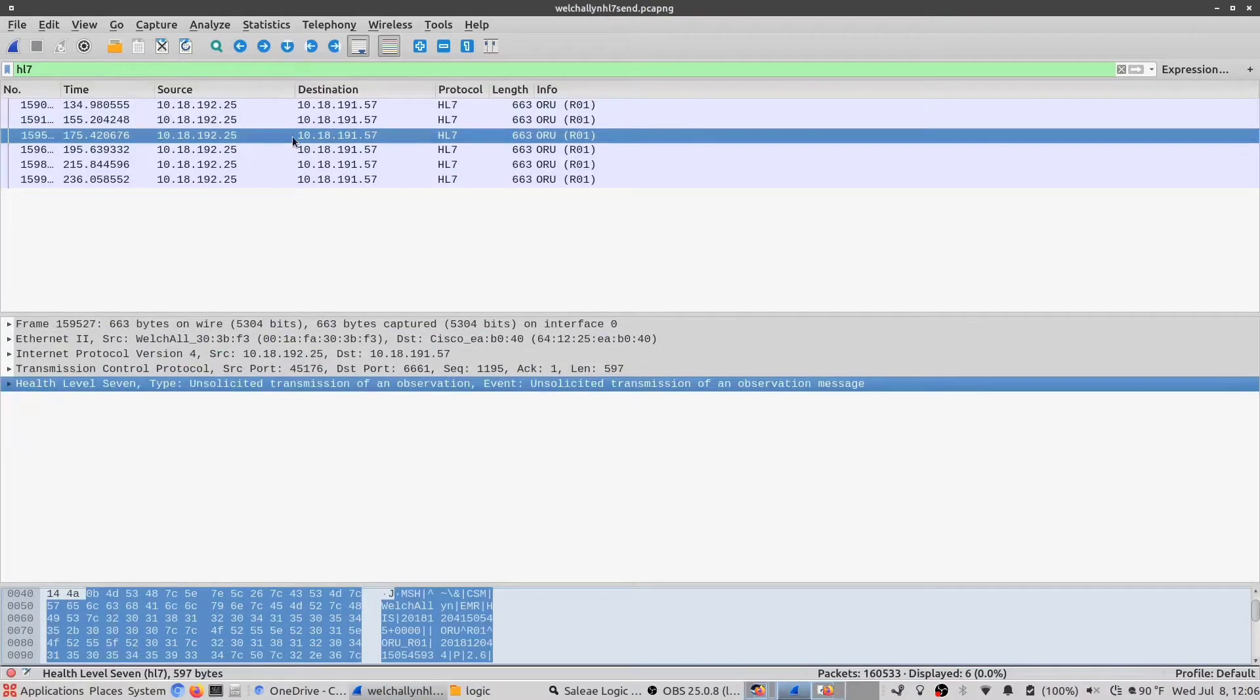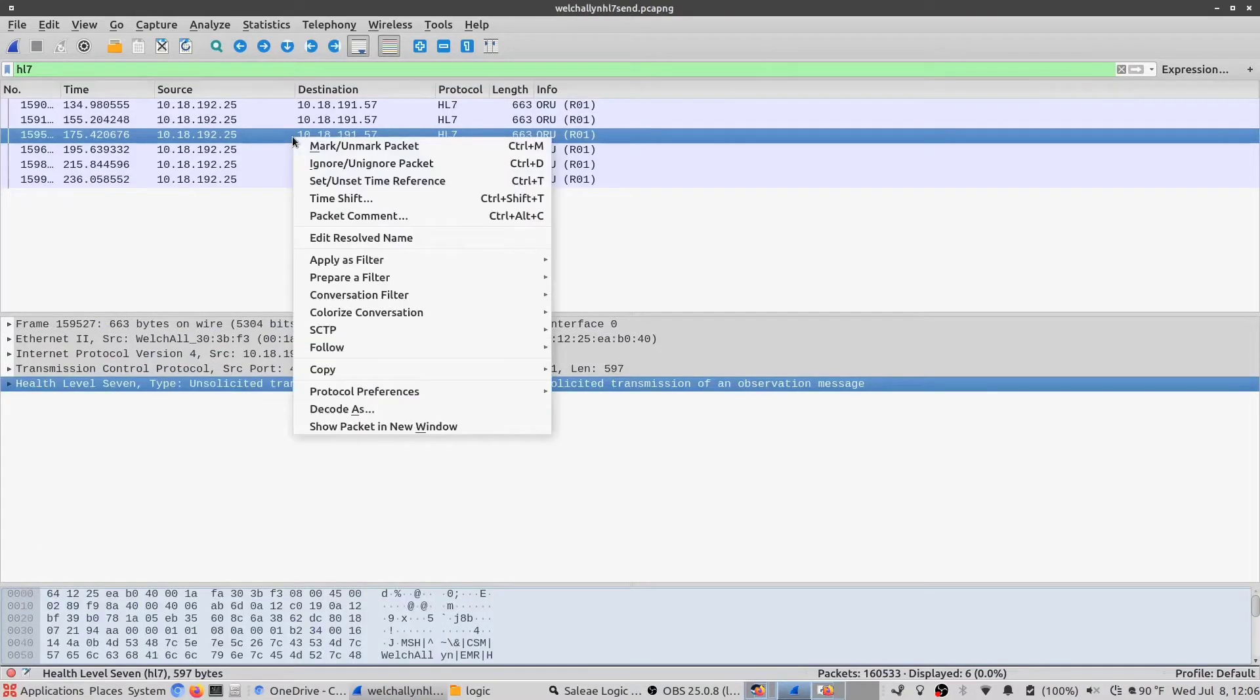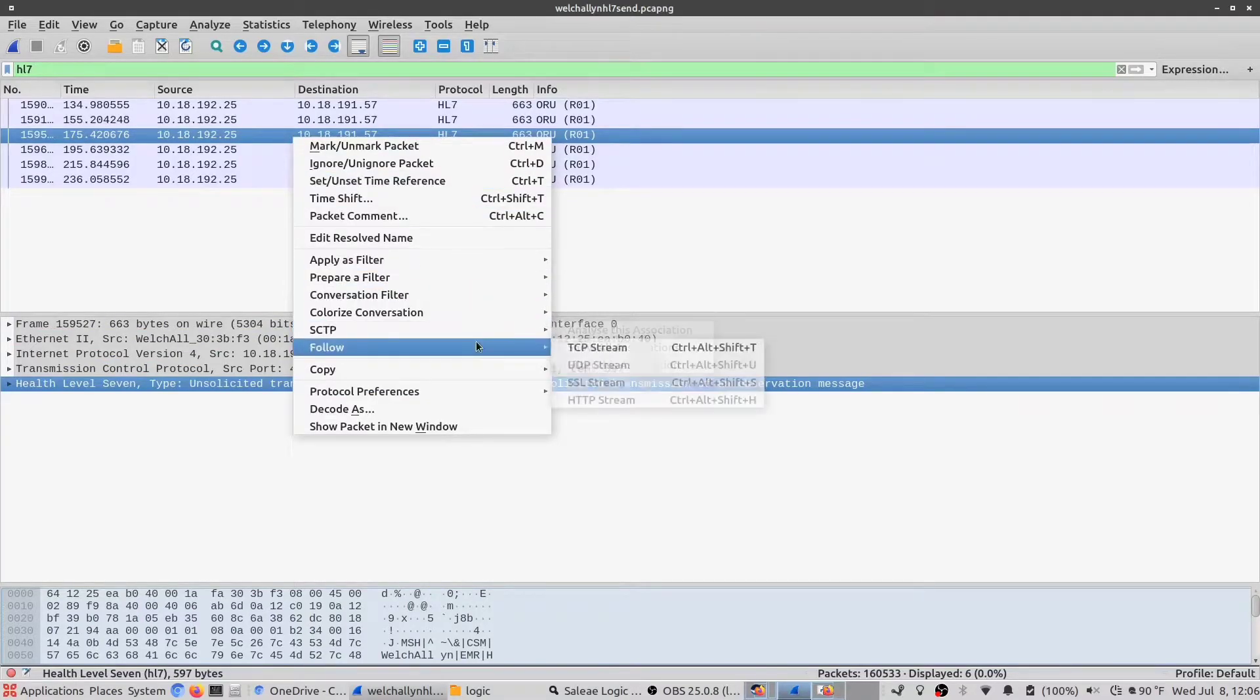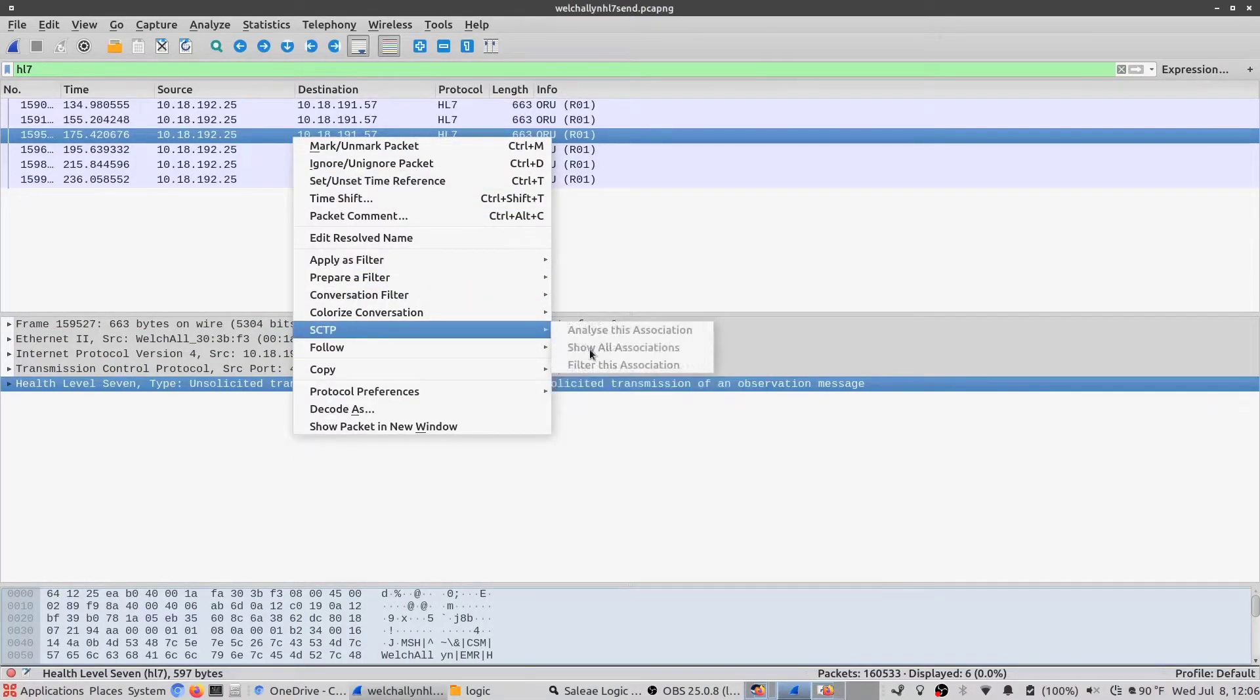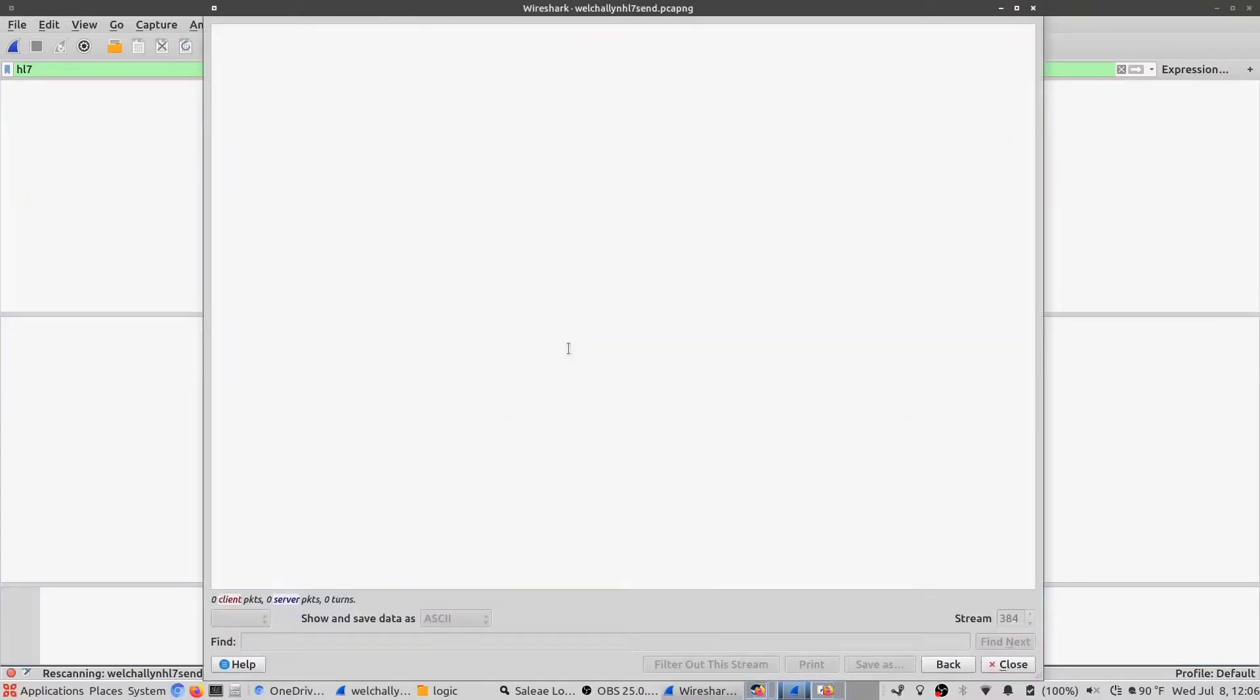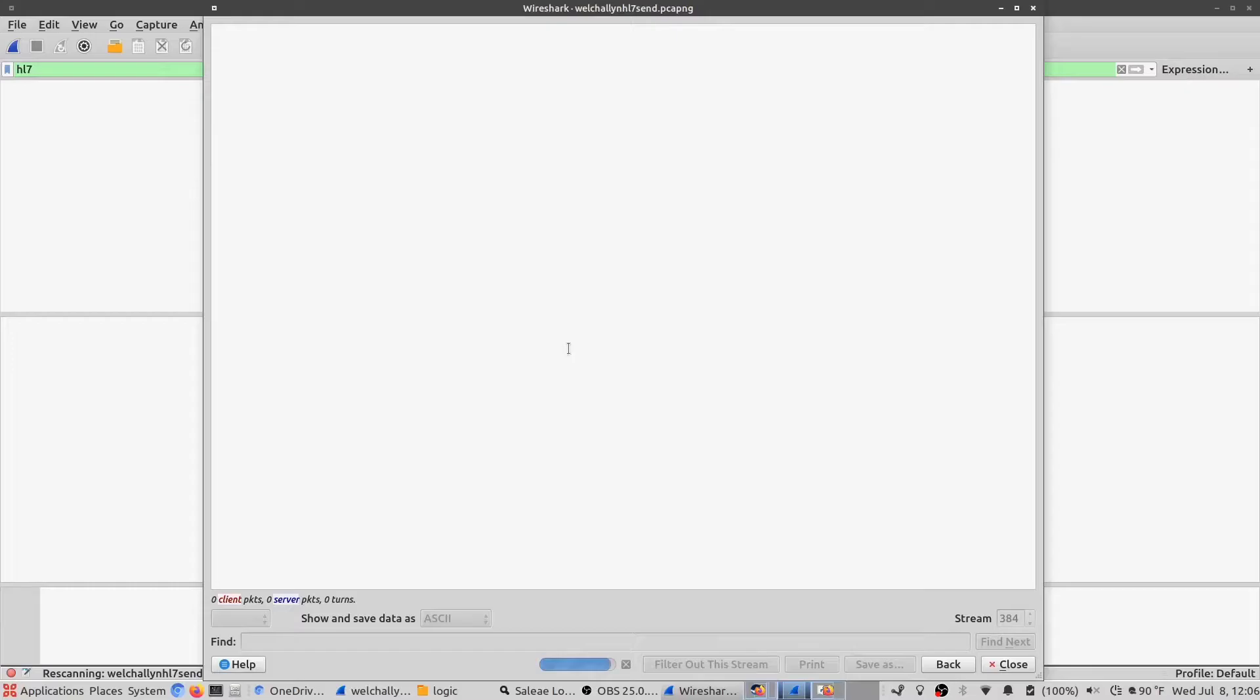Now if you right-click on any one of these packets and go down to follow and then follow the TCP stream, it will start pulling the context of this packet.